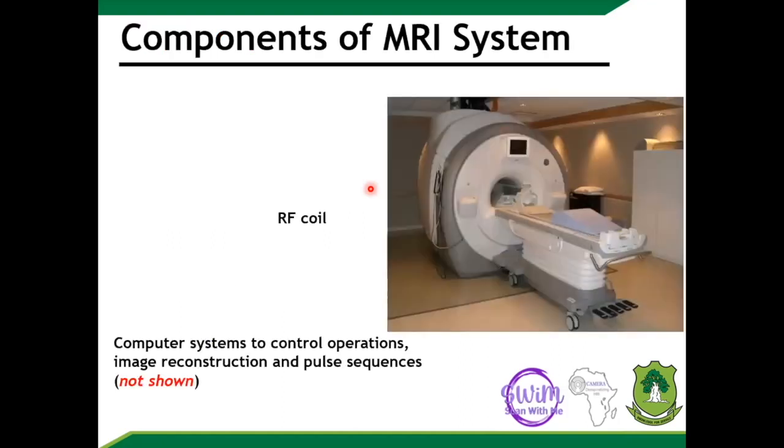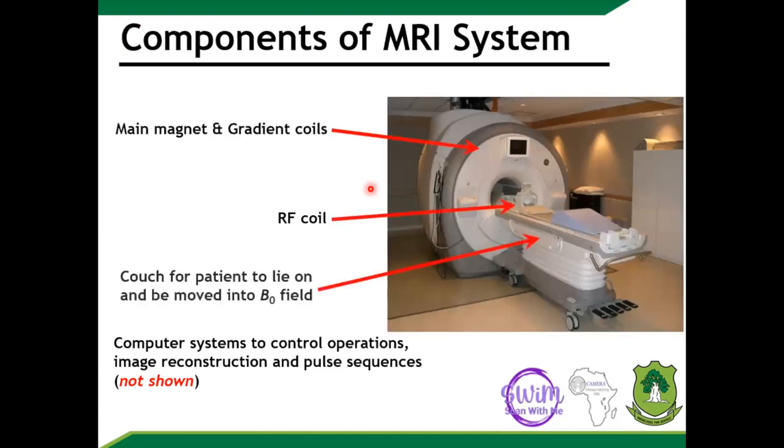So this is the last slide, and then I'm done. We are all familiar with MRI. The main magnet is what is in this building, together with the gradient coils incorporated into it, and that does the first-degree realignment of the spins.